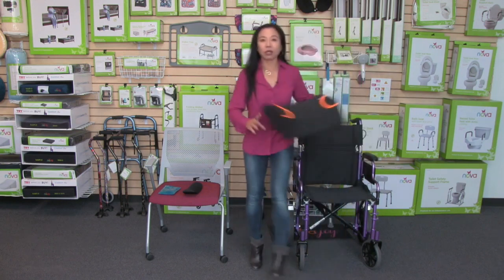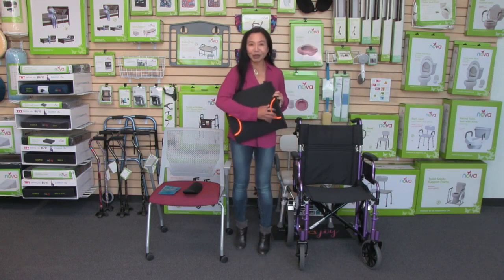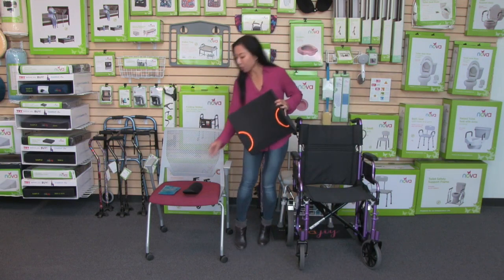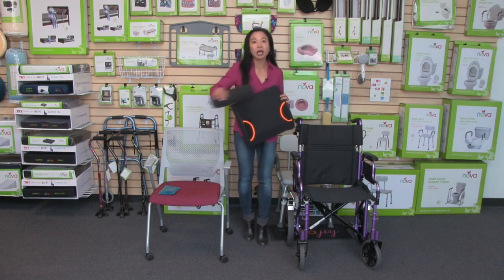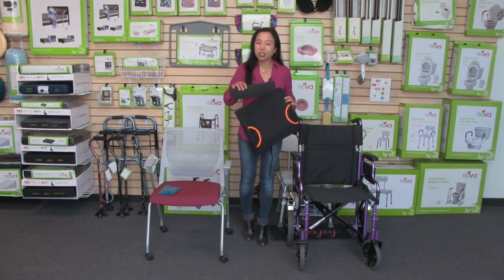This lumbar cushion has a pocket here on the lower section, so you can also add an additional lumbar support. This just rests right up to your lower back to give you that additional support.